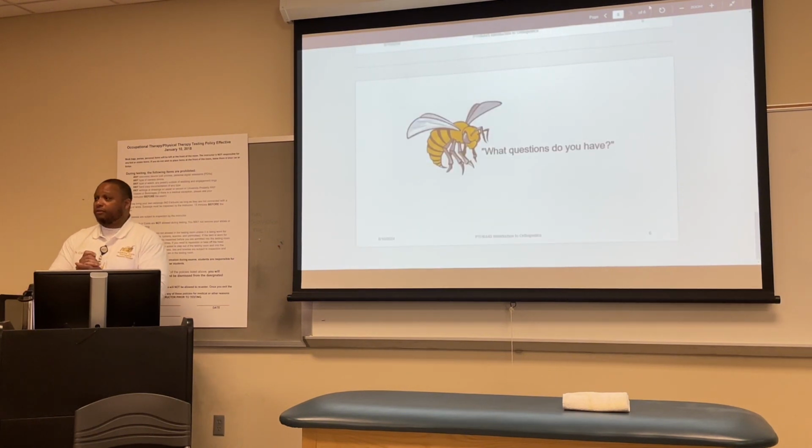What questions do you have? So when we do Goni, anyway, let's check my question, sorry. You said when we do Goni. Oh, yes, okay, so in the practical, would you want us to verbally say where we would stabilize if they had any compensation? Yes. So where you would stabilize or how you would instruct them.